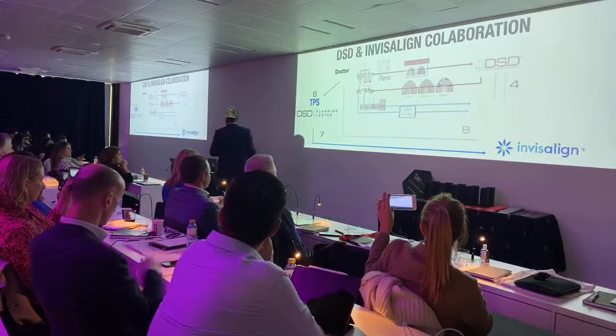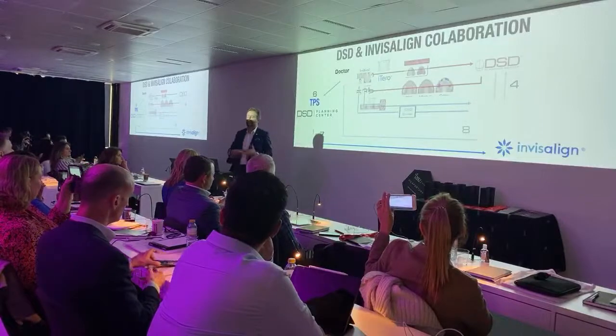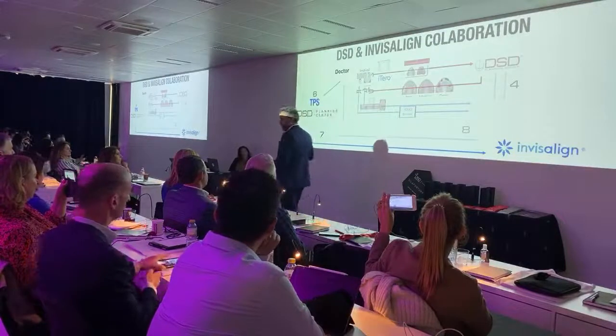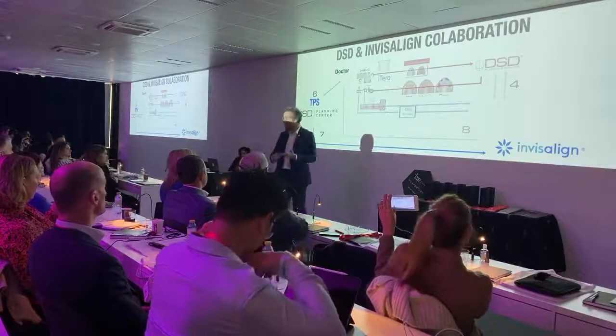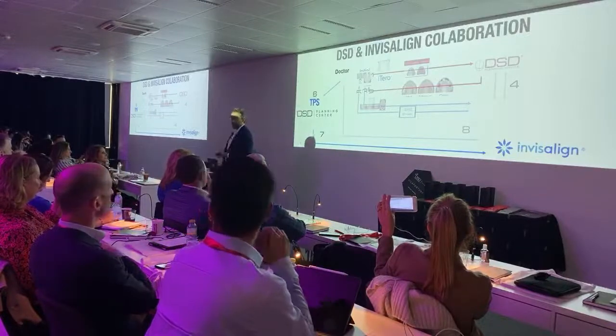So this Invisalign option is basically for most of the patients that you're already kind of sold or convinced need ortho. It doesn't mean you cannot use it before also, because you still have ideal design thinking on ortho, you still have all the images, the mock-up, and the color code. So of course you can, it's up to you.